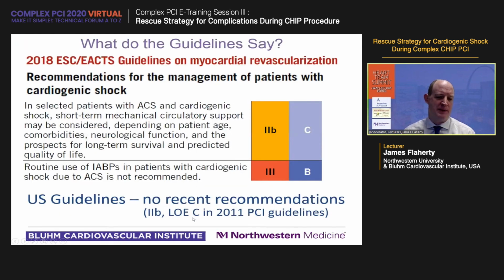The guidelines in Europe and the United States don't really provide heavy recommendations for the use of supportive devices, even in patients that are already in shock before you start the PCI. At best, we get a 2B recommendation, and that's partly because the evidence is lacking. But again, these are very hard things to prove.